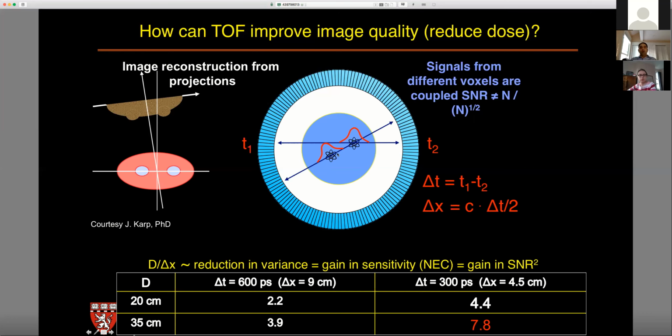That buys me a lot in terms of counts, because if I had 100 of those, let's say in this area, instead of distributing those 100 along all the 1,000 pixels here and getting only 1 count per pixel, I'm going to distribute them over 10 pixels here only. And my 100 counts will come 10 into each of those voxels. So I'll have a lot more counts per voxel in a smaller area and no counts elsewhere. And that's going to contribute to my signal to noise ratio.